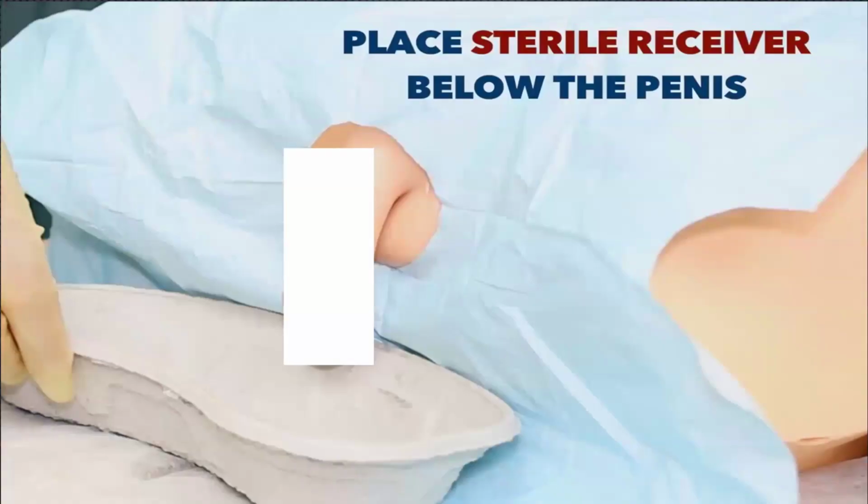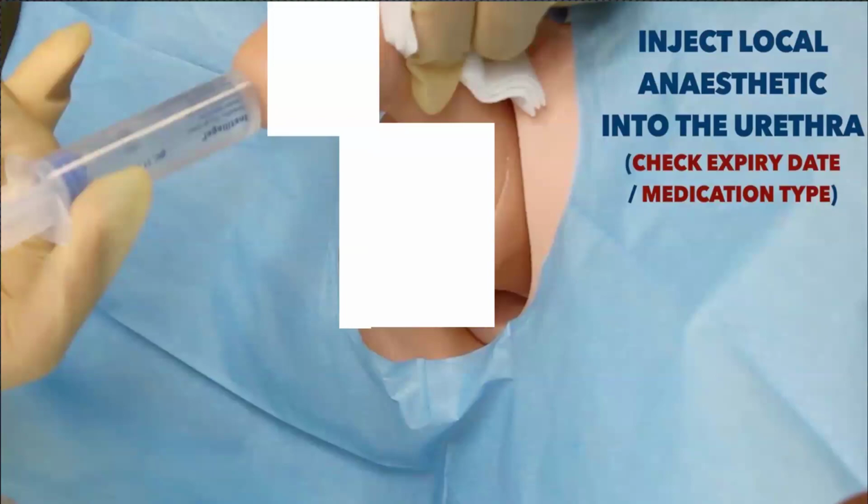Okay. And the next thing would be to anesthetize the urethral meatus. Most of the time, the catheter packs have those gels, and they'll serve three purposes. First of all, to check that the urethral meatus is free, that there are no obstructions like strictures. Again, it would help numb up the place, for the patient's comfort, and then it would help for easy catheter passage. So after you've done that, you need to give that a couple of minutes to work while you get your catheter ready.